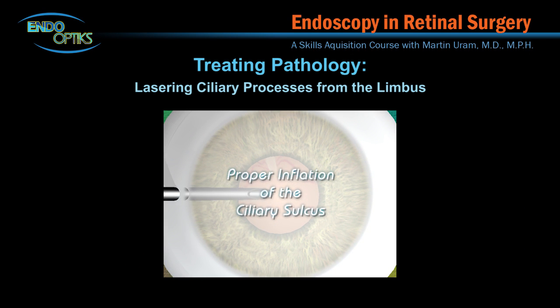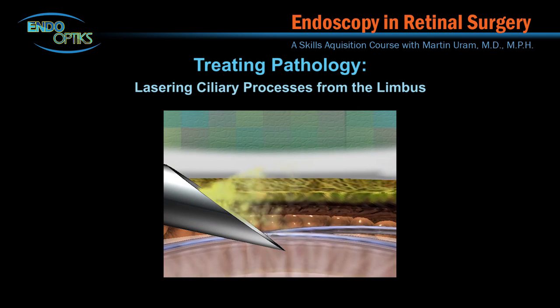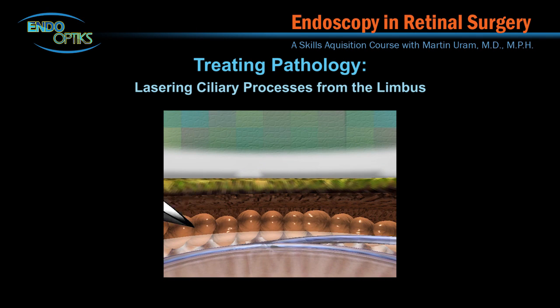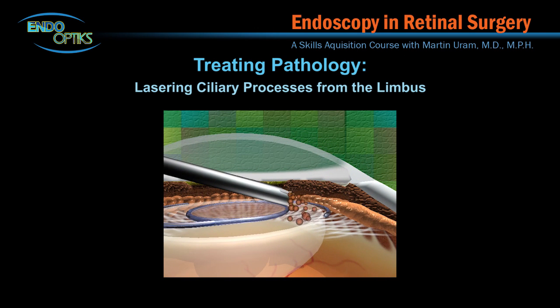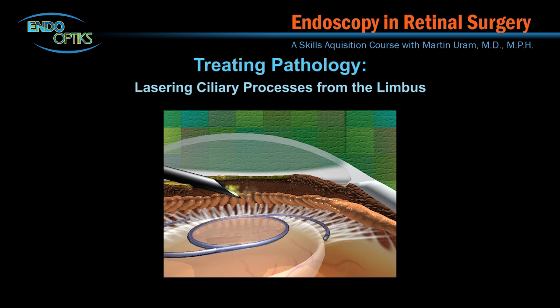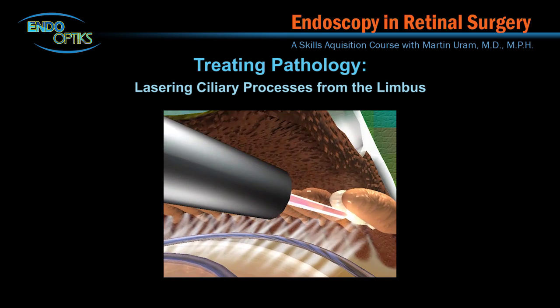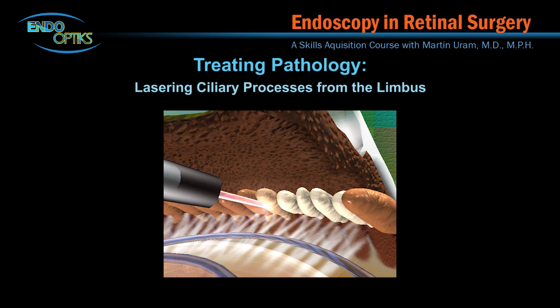ECP can be performed from a limbal approach, and the key to this is inflating the sulcus well enough to view the entirety of each process and the zonules coming off of them. The sulcus is inflated using viscoelastic, and if insufficient inflation is performed, addition of more viscoelastic is required. The ciliary processes are whitened in their entirety by the laser, and then all of the viscoelastic is removed. This is a relatively simple one-handed technique of laser endoscopy.